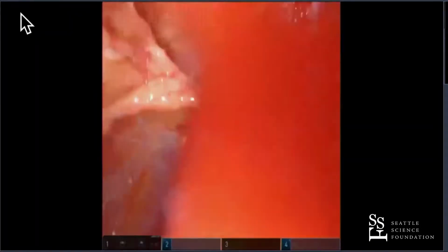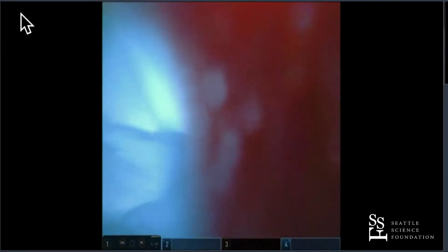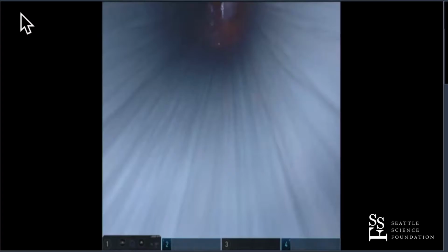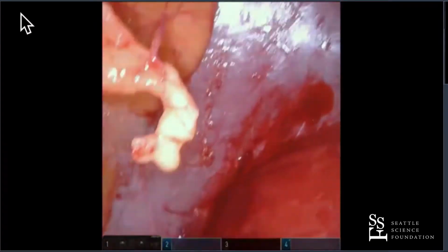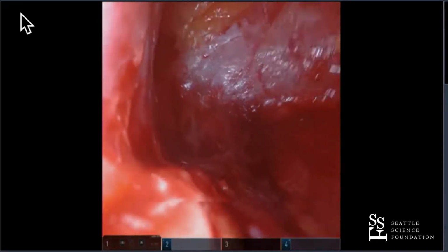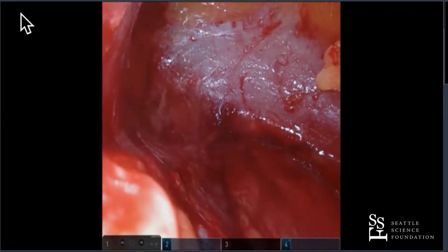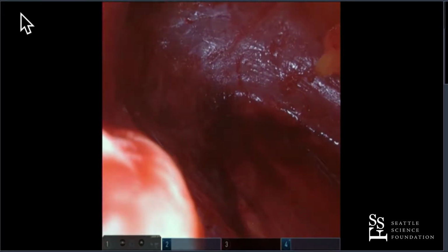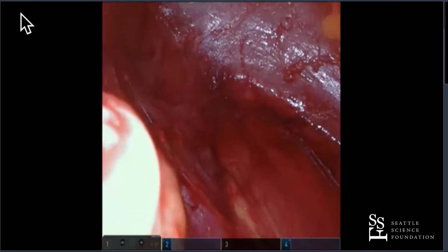There we go. Okay. Yeah, there's stuff inside the cannula. Yeah. Good. Okay. So, we're going to look at the posterior body wall here, right there, Brando. Just hold there. And I'm going to make my posterior incision here. Knife.